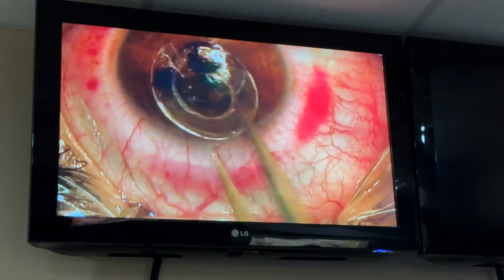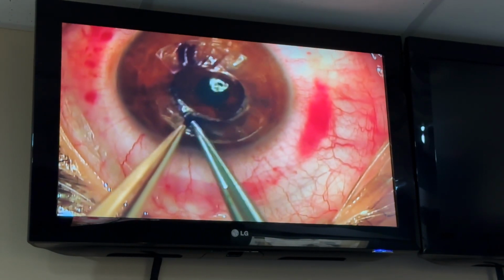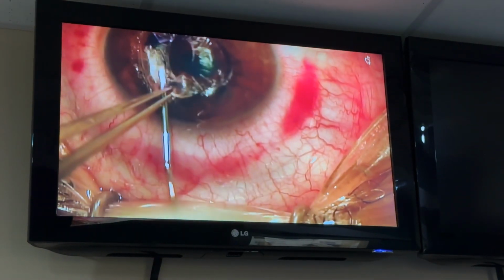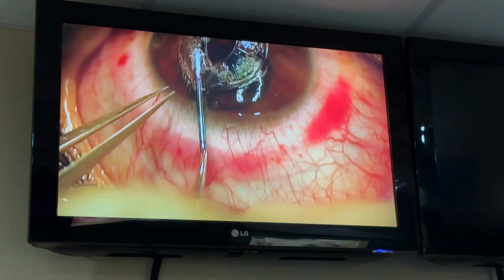This is the inlay, which I'm going to prepare to implant. I had dehydrated it a little bit to get a little more stiffness, but you may not need to do that. This tissue is fairly rigid. It is gamma irradiated, so it should be able to go without too much fuss. Again, this is one of my earliest cases, and I'm actually going to be using a 330-degree segment.